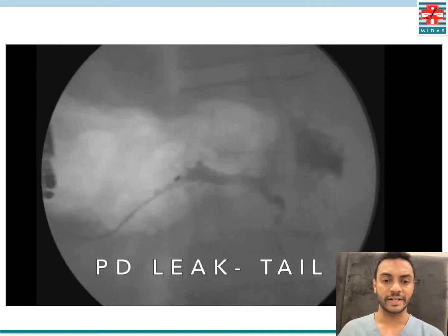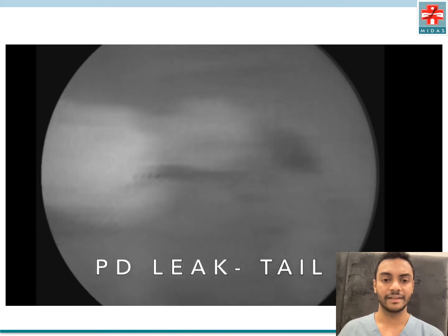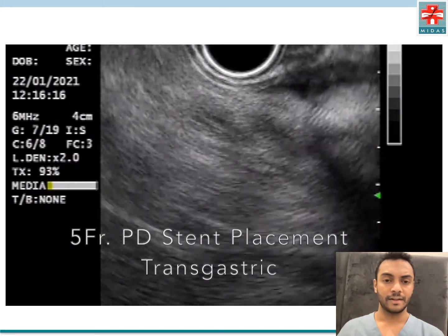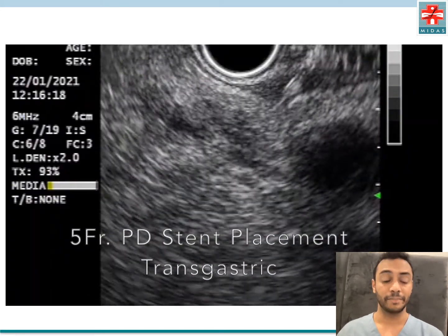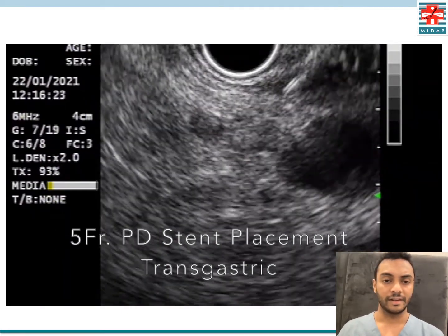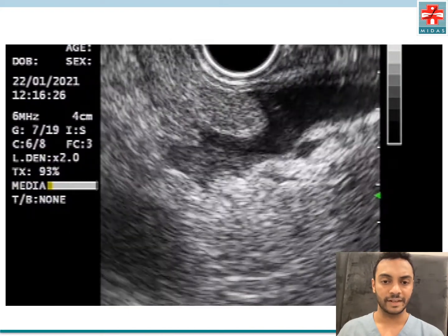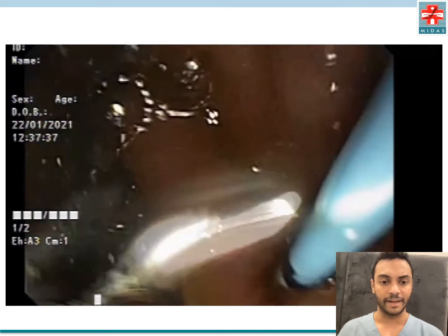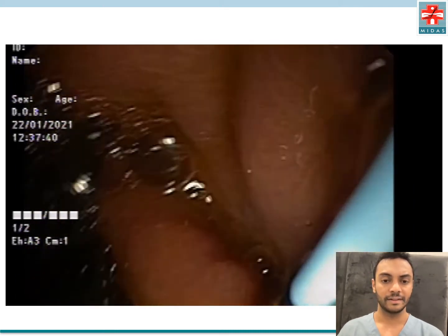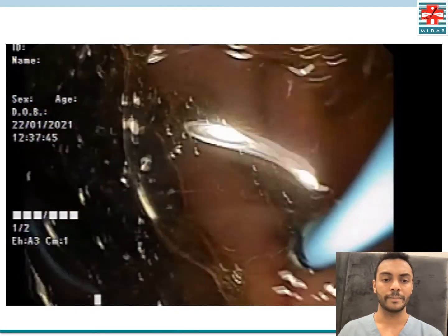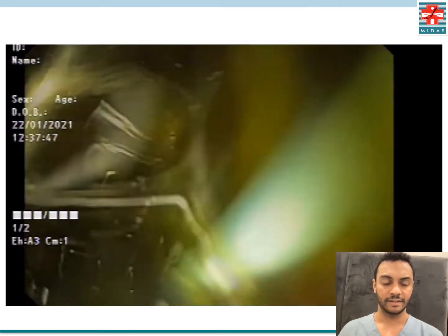Contrast was injected and demonstrated a leak in the tail of the pancreas. Next, we proceeded with placement of a 5 French pancreatic duct stent — with much difficulty, gradually the stent was advanced across the gastric wall and the pancreatic parenchyma into the pancreatic duct. This is the endoscopic view demonstrating the deployment of the stent in the gastric lumen.